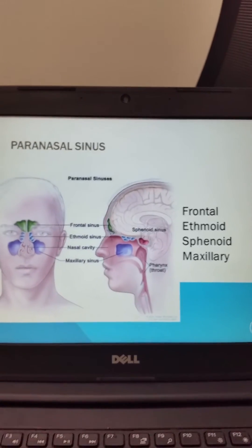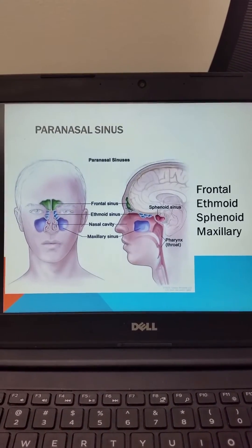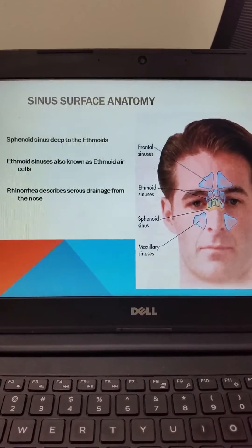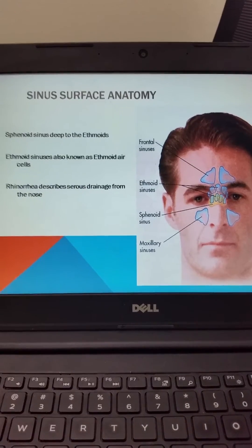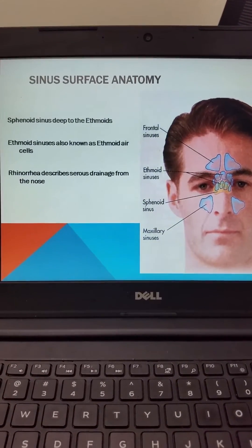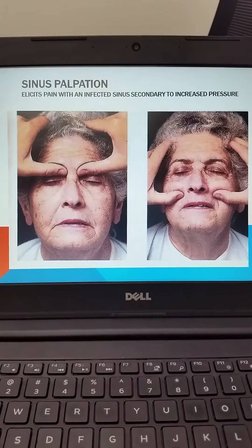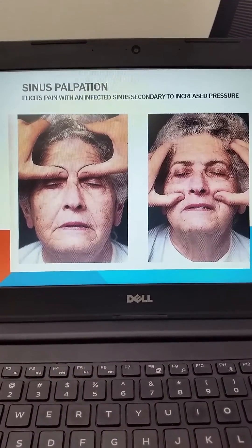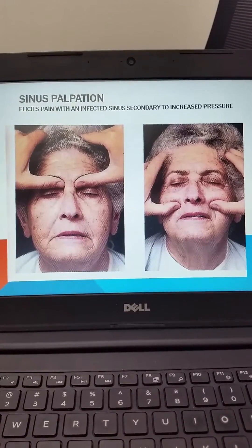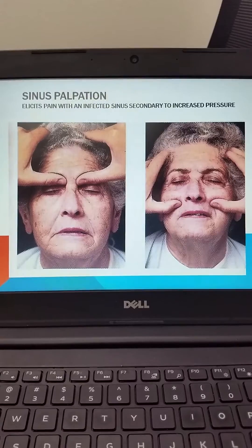Once we've done the internal nasal exam with our speculum and otoscope, we then remember where our frontal and maxillary sinuses are positioned. These paranasal sinuses may be exquisitely tender during sinusitis. The sphenoid sinus is deep to the ethmoid sinuses; the ethmoid sinuses are sometimes referred to as the ethmoid air cells. Serous drainage from the nose is described as rhinorrhea. When palpating the sinuses, pressure can be exerted medially and superiorly at the root of the nose for the frontal sinuses, and then superiorly just below the zygomatic arch to produce pain and tenderness due to increased pressure within the sinus during sinusitis.